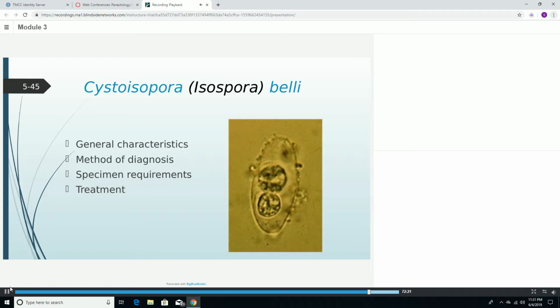It's going to be a very mild infection. Here we're usually going to look for oocysts recoverable by the zinc sulfate flotation technique, and they stain very well with iodine. Again, most often we're not going to come across this organism, but you can take a look here at the egg and make sure that you draw it out.